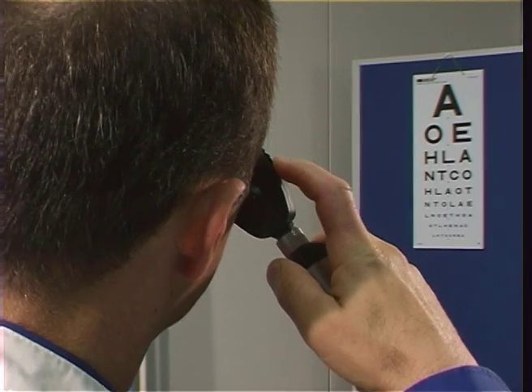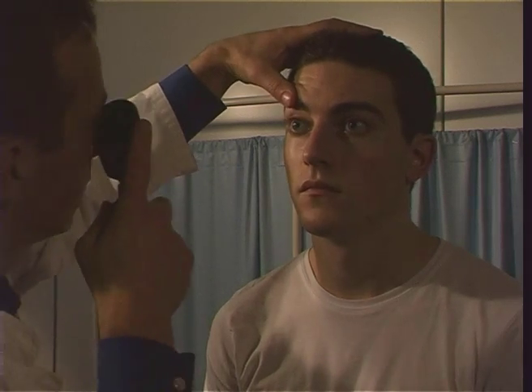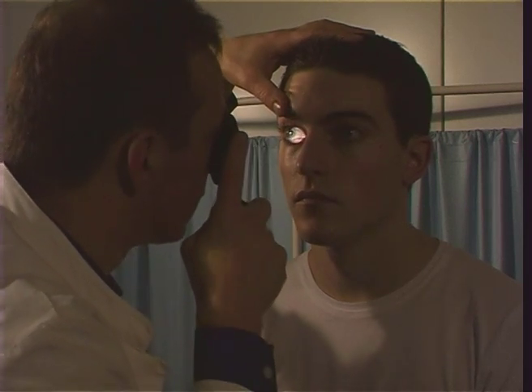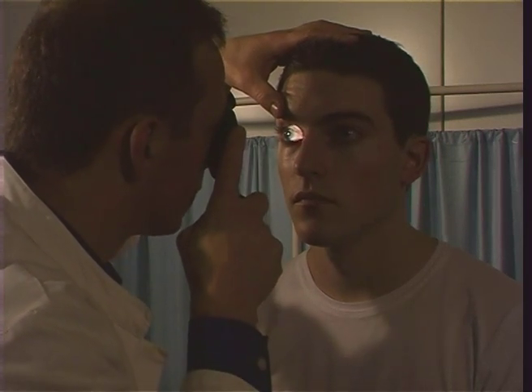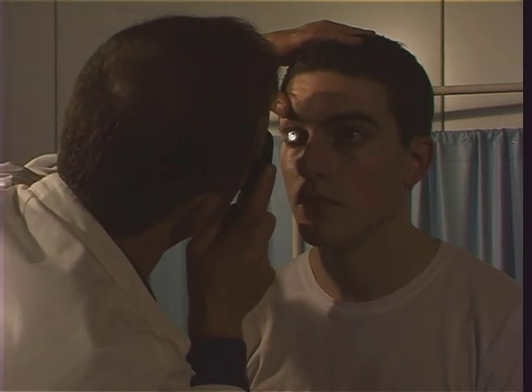It is recommended that when you examine the patient's right eye, you hold the ophthalmoscope with your right hand, look with your right eye, and vice versa. This allows you to get as close to the patient as needed because both yours and the patient's noses are not in the way. The closer you get to the patient, the better, as the wider your field of vision will be, just like looking through a keyhole.